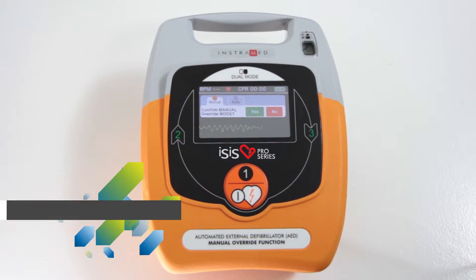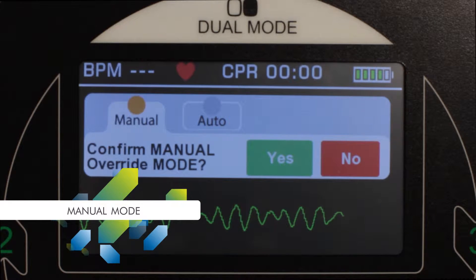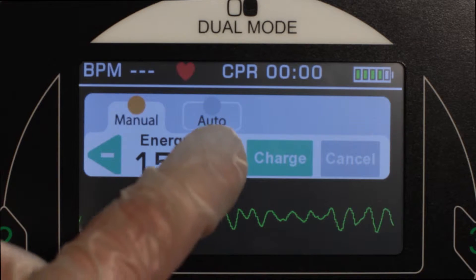When in manual mode, if the user has had the required training, they have only to press the corresponding button on the screen and select the desired charge up to 270 joules.